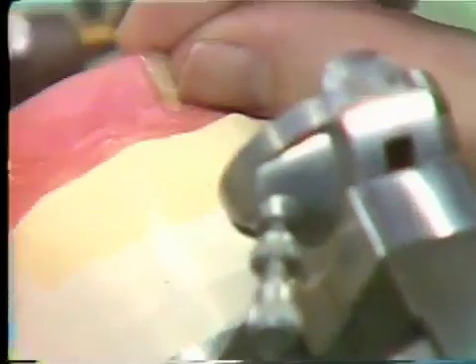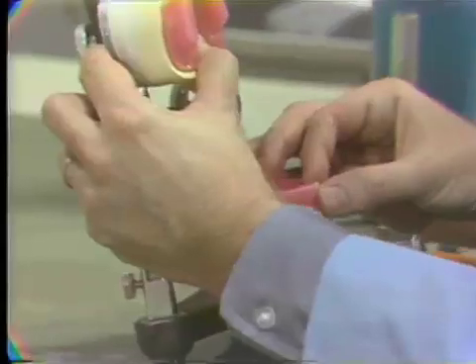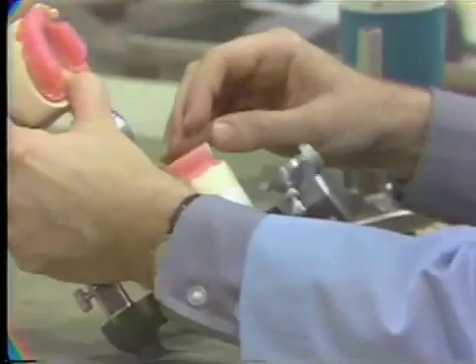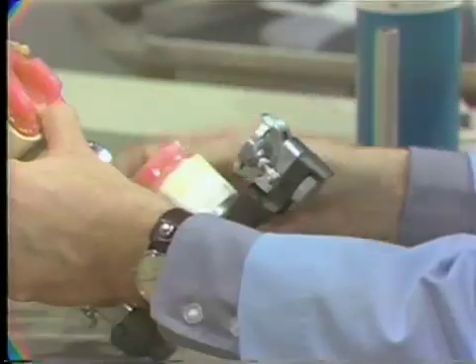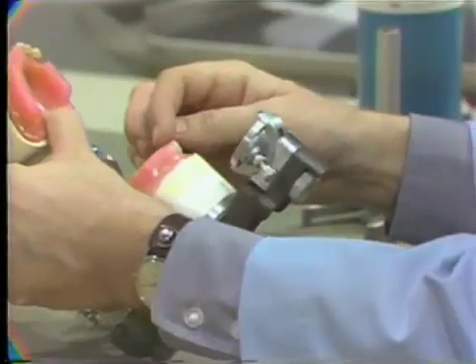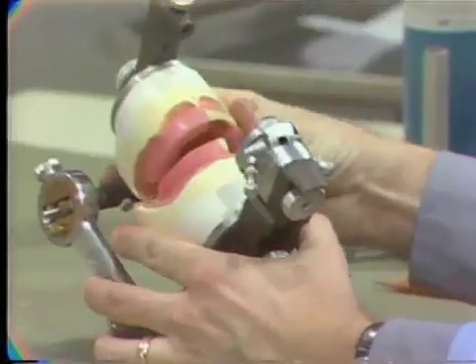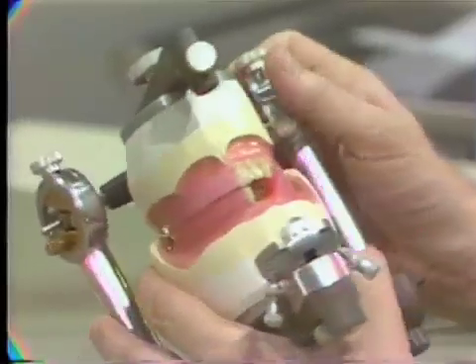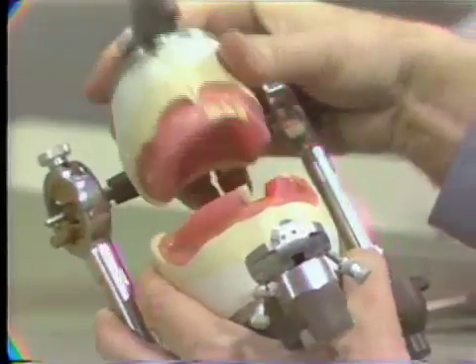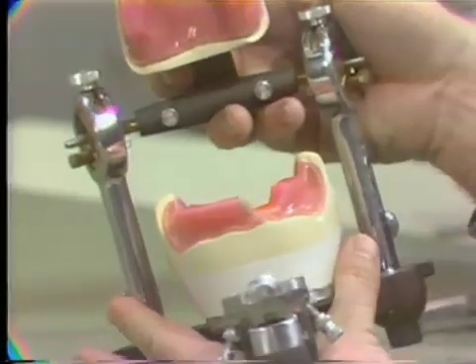I'm trying to line it up so it is symmetrical with the other part of the wax rim that has not been removed yet. That still acts as a guide. And when we finish, we should have some labial inclination to this lower tooth. And also, the incisal edge, no, I think that's arranged correctly. The incisal edge should be even with the occlusal plane, or the lower rim. All of the lower teeth will be even with the occlusal plane.